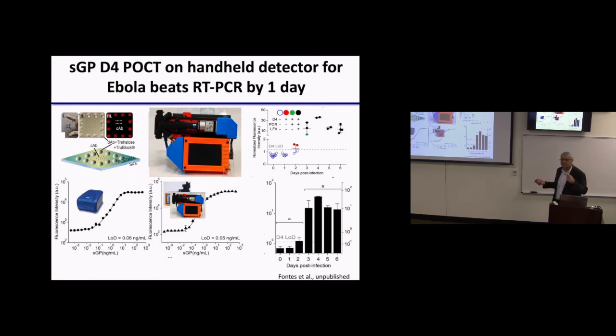So these are the control animals. These are animals that were exposed to Ebola, either in the eye or intramuscularly, and then they give them different drugs, prophylactics, vaccines. We just asked them to take blood from the control animals. So we piggyback on experiments where, from the control animals that are infected, we get blood samples and they do the analysis. This detector has been sitting in Galveston for months now because Cassio and Jason went there, trained the technician Crystal, and then the lab goes hot, she takes everything in, and we just get emails and data streams from Galveston.